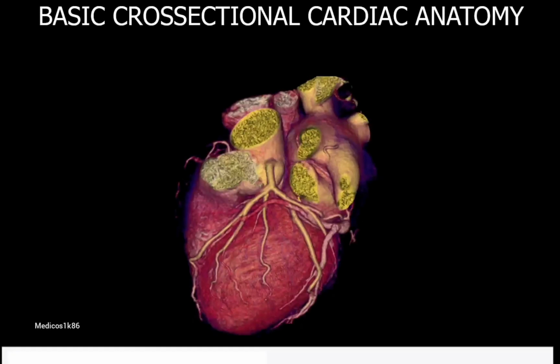I think everyone has maybe a little bit of experience, maybe more experience, medium, and maybe they are advanced on the cardiac scan. But before the cardiac scan, I believe that we should know some cardiac anatomy. If you don't know cardiac anatomy, it's not easy to get good image quality without motion images, because everyone knows the heart is moving and we cannot stop the heart. Any machine, any speed cannot stop the heart.